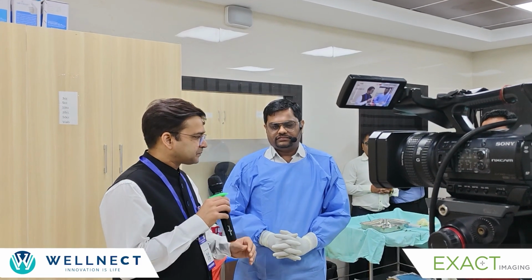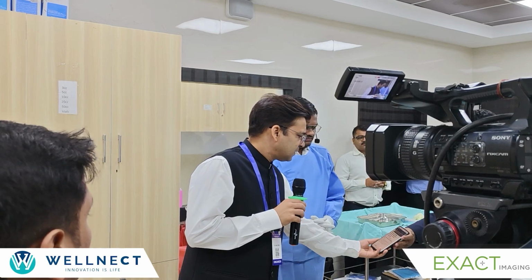How much is the difference between the two? Because the cost factor will come in here. In every department there is a machine which you are using for multi-purpose. So has any trial been done to show that this machine is superior, or do we have to go only for this machine and not the standard machine? Anybody from the company side can also answer.